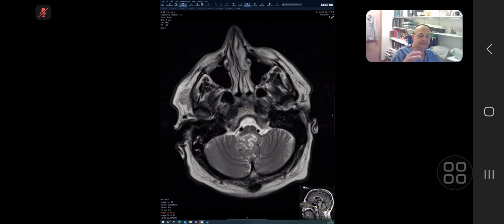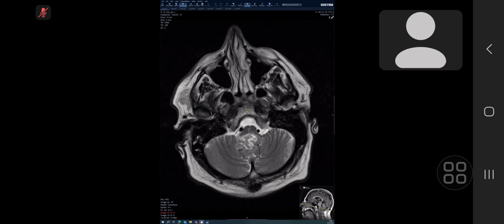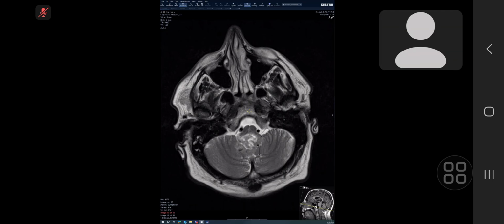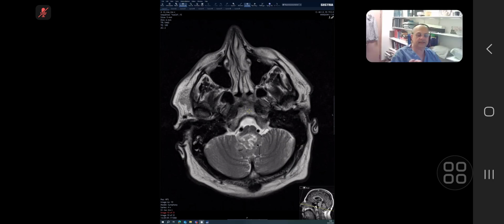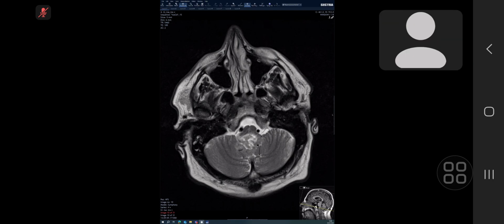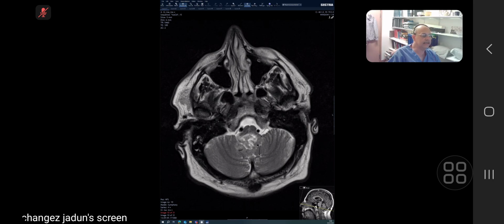The normal system is you look at the T1, you look at the sagittal, you look at the coronal, non-contrast, then you ask for contrast. So there is a system that you go through. So in exam, you have to go through the same system that you have in your day-to-day life. Exam is no special. You only go through the same system that you have in your day-to-day life. So what other non-contrast sequence would you want to see? Besides this, I like to look at the T1. What sort of a T1, axial, sagittal, coronal?